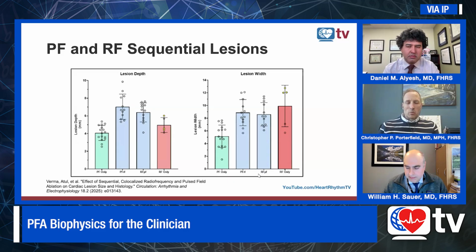There have been a number of studies. We did it in pigs, really trying to get as much detailed thermal measurements along the esophagus. There have been a few studies that I think may have been on one of your slides, looking at the esophagus, even doing pulse field on the esophagus to see what happens to the tissue. Unfortunately, the esophagus is usually spared from any type of thermal injury from PFA. Even if there is a lesion created, it does not provide further necrotic change. Yes, so a very important point, and it is on one of my other slides. But yeah, it's an interesting method, and I think when we go to the monophasic, longer train, going into a unipolar configuration, we will be seeing more heat, more thermal.